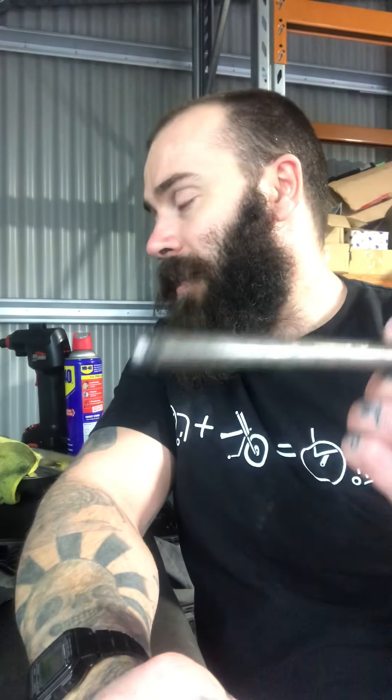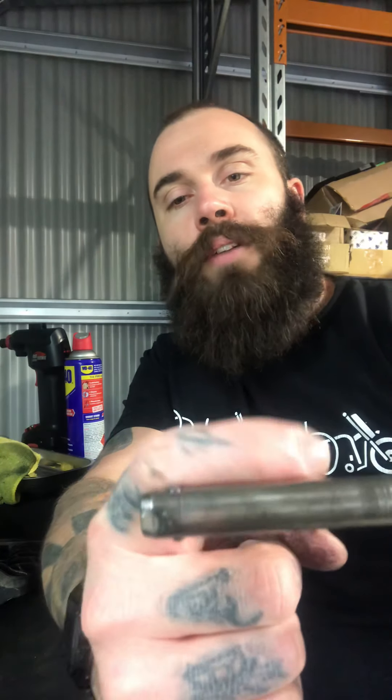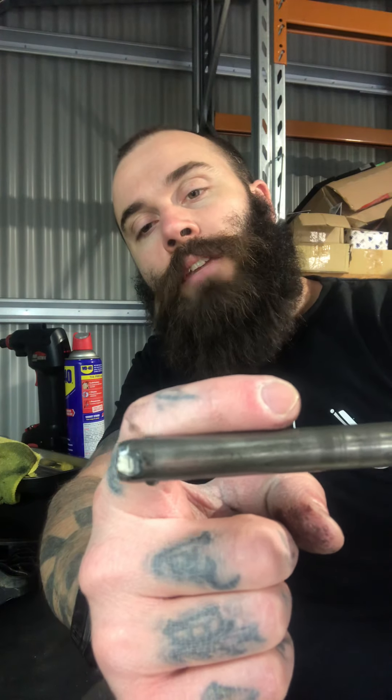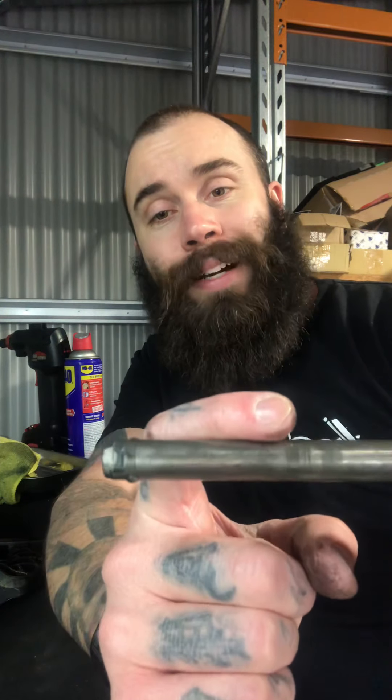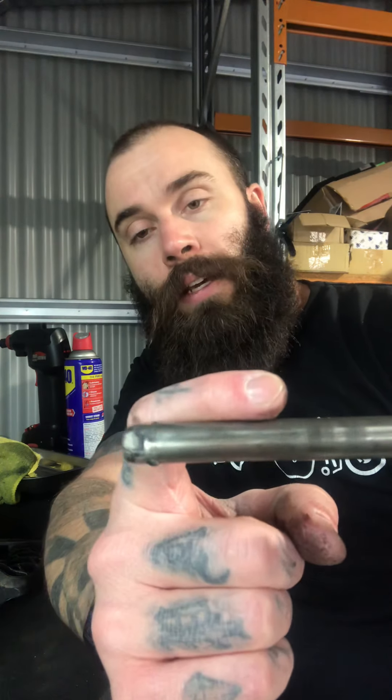But sometimes what happens is it won't actually go all the way in. The reason for that basically — I haven't got a receiver here to show you — but basically what happens is, let's say for example my finger is basically a receiver: if it's not wound in far enough, you won't get the ball bearings going past the receiver so it will lock in. What happens is it won't go all the way past it and then it will basically slip out.